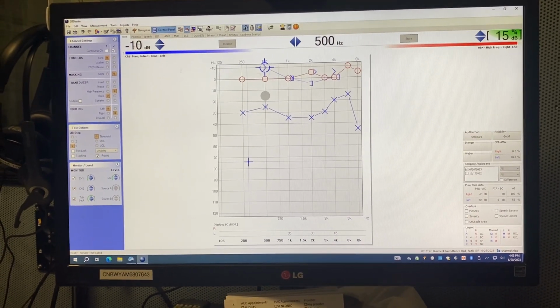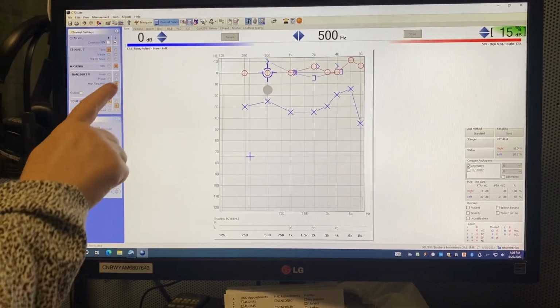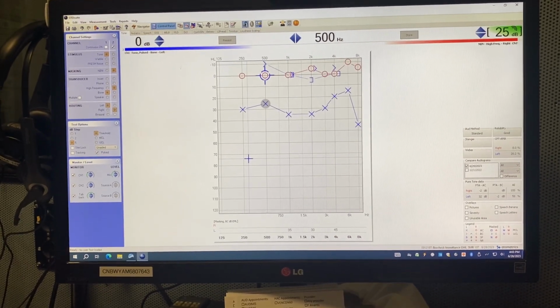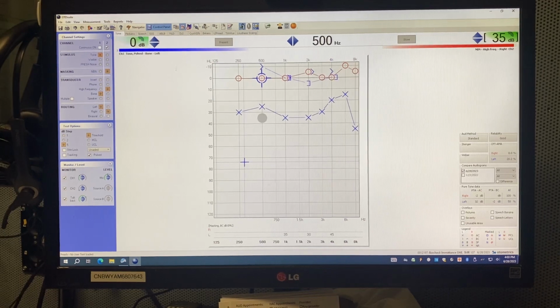No response, up 5 on your tone. No response, up 5 on your tone. We have a response. Now I go up 10. We have a response, up 10.